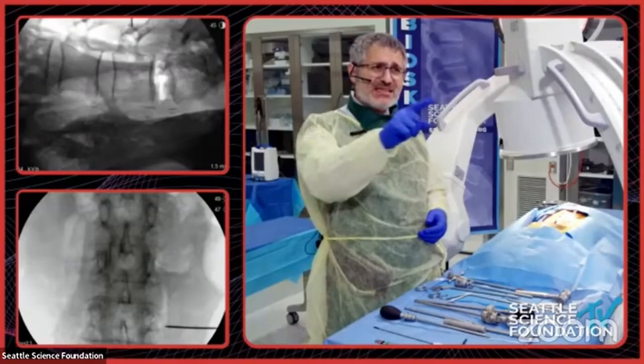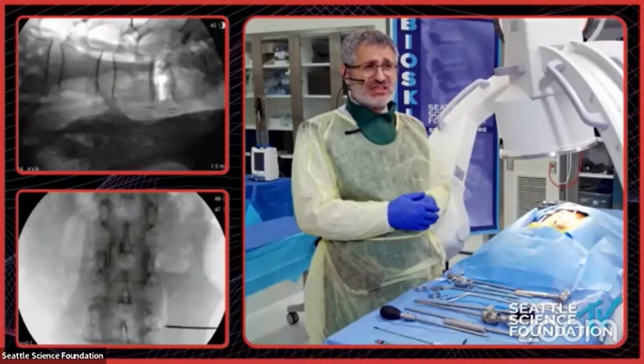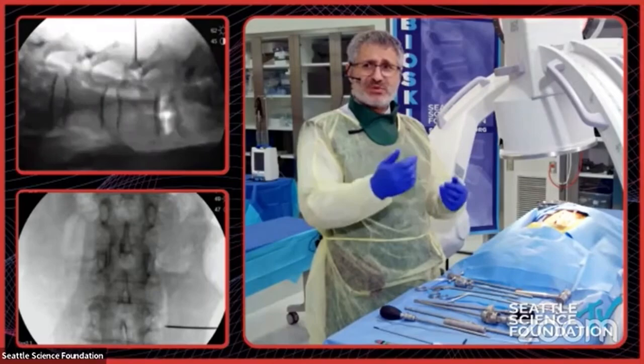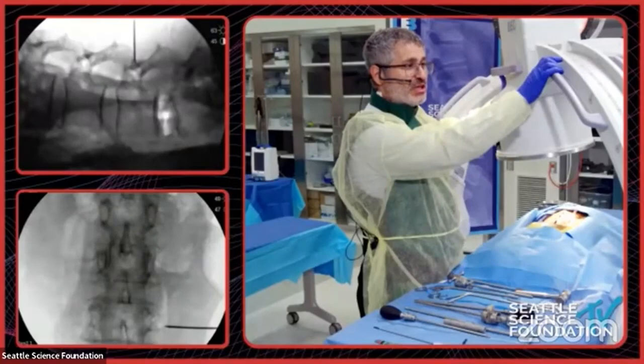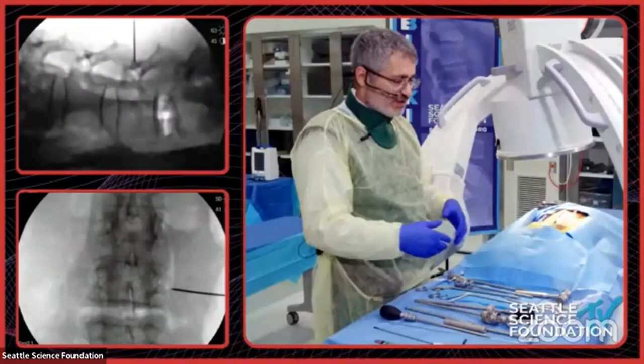I see that you guys don't see the entire lateral, and AP is a little cut off. I can change it with my machine a little. I control the X-ray machine myself, and we have a protocol to teach all the people who help us in the OR the motion. One of the first things I tell them is: this is up, this is down, this is north toward the head, south. Then we talk about those nomenclature so that there's good communication.